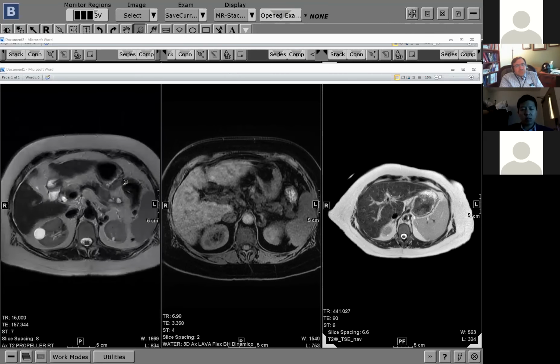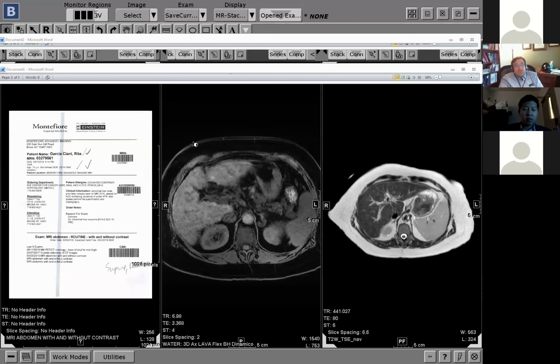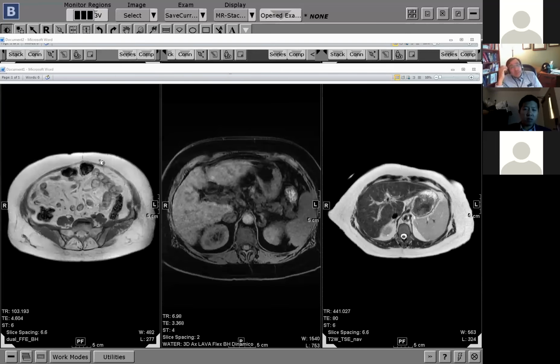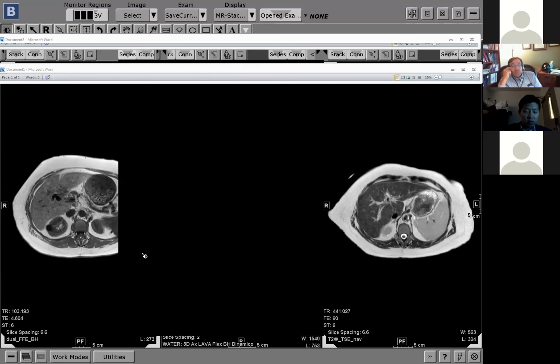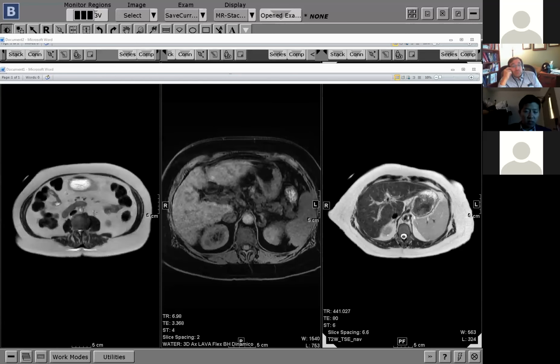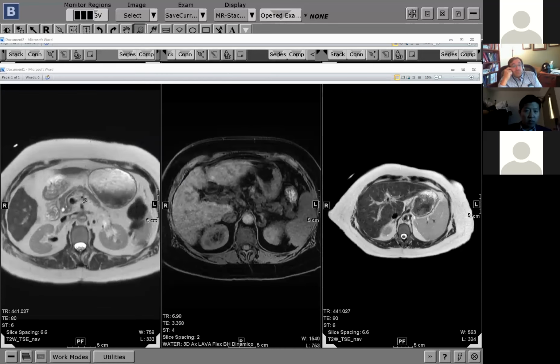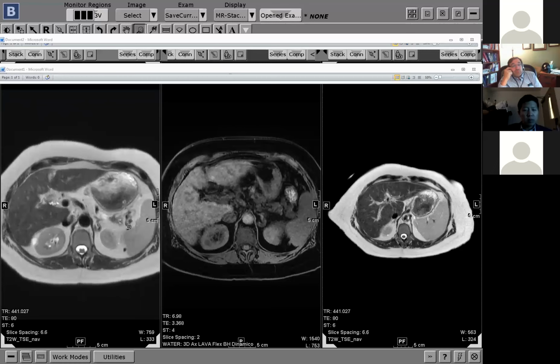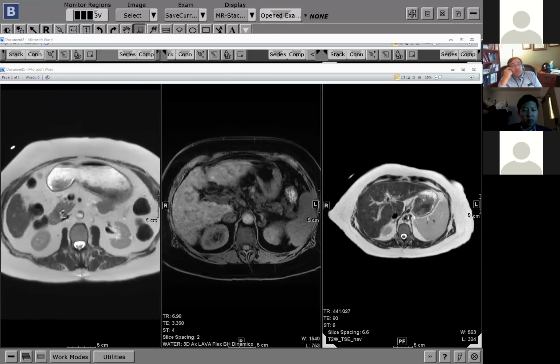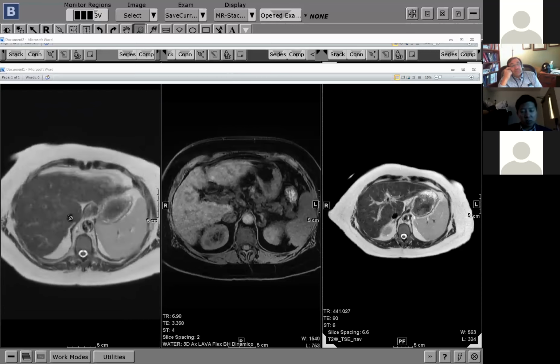Then the oncologist says, well, the patient had a CT and MR about a year ago, can you take a look? So this is our MR from just about a year before. I'll admit I read the case, so it's hard for me to judge if it's prospectively callable, because once you know it's there... Here's the pancreas, and admittedly the tail is a little less plump than the head and neck. There's a slight change in the caliber of the duct, maybe. And of course, no mets.